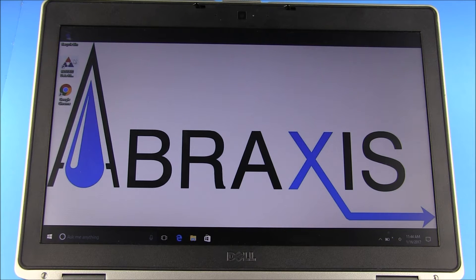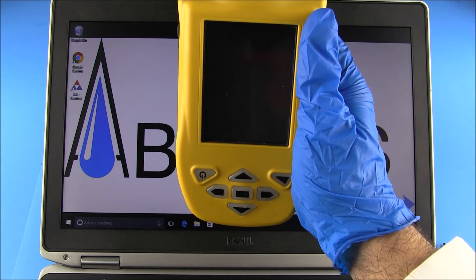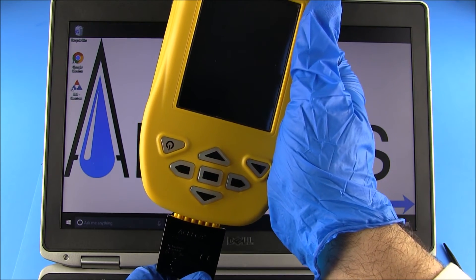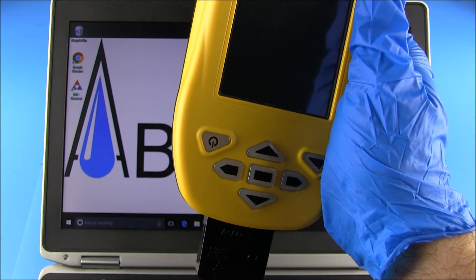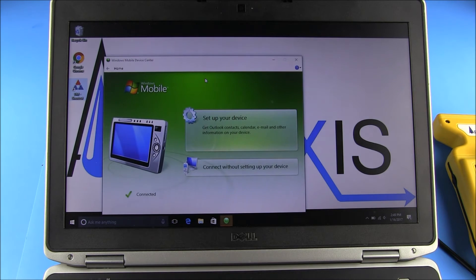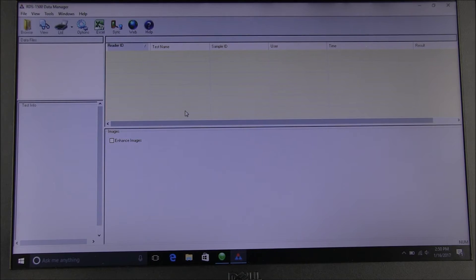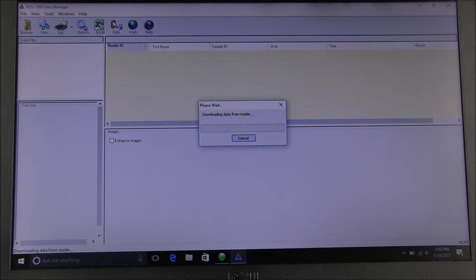A new icon should now be seen on the computer's desktop. Be sure the reader is turned on — note that the reader may be on with the screen turned off. Connect the reader to the computer using the USB cable provided. Activate the program by selecting the RDS-1500 Data Manager icon on the desktop. From the toolbar at the top of the Data Manager screen, select Sync; results will then be copied from the reader. Please note that the results will not be deleted from the reader and will appear in both the reader and the computer until deleted from the reader.